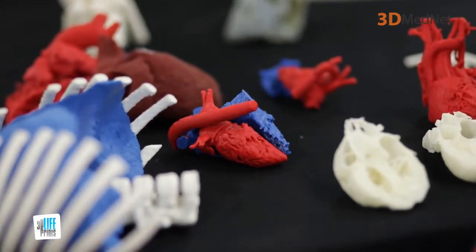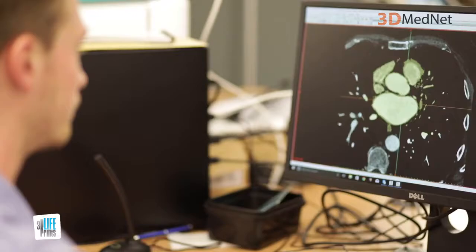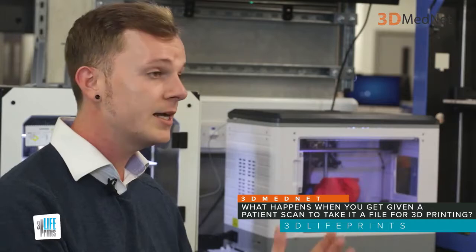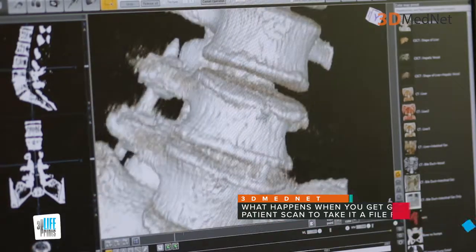Okay, so at the heart of each 3D print is the scan which it was obtained from. These will normally be from CT scans or from MR scans, and essentially our segmentation process starts by identifying specific Hounsfield unit ranges within the scan data. So you will have parts of the scan such as bone or contrasted blood which will show up as a very high Hounsfield unit range that allows you to segment out very complex ventricular data, bone data, metalwork within the scan.